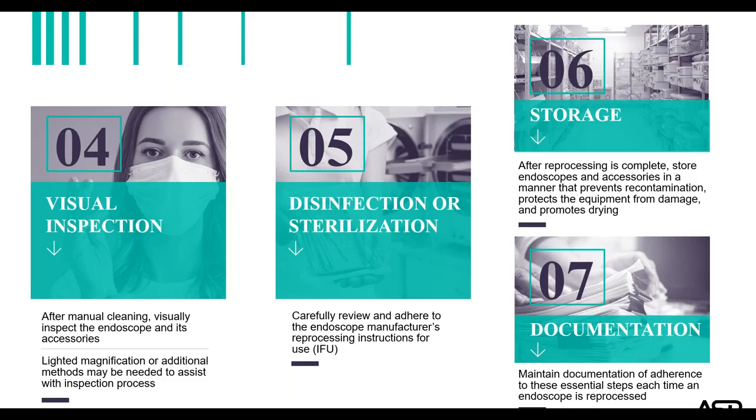Always wear gloves when handling clean scopes. And I would just add to that, just always wear latex-free gloves whenever you're handling a scope. And have a method in place for identifying whether that scope's been reprocessed, because you certainly wouldn't want to use a contaminated scope on a patient.